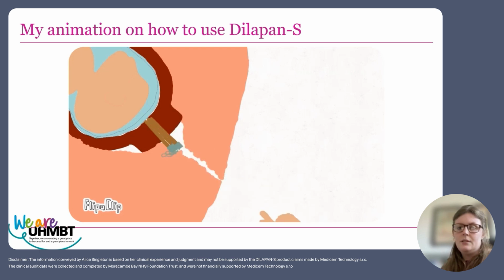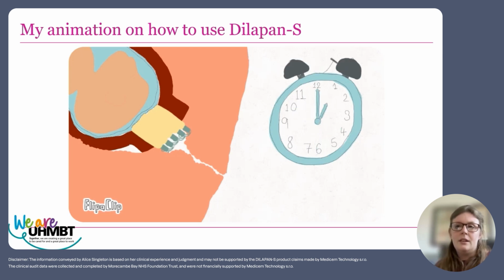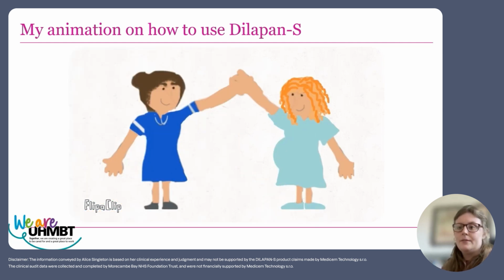In all 3 methods, you're going to do essentially the same thing, making sure that you've just put enough lubricant on the end of the Dilapan to assist with the administration of them through the cervix. You're also going to ensure, once you've administered all 5, that they are definitely through the internal os by giving them a little push up digitally. Once they've been in for the designated amount of time, you can remove them by pulling the strings. A gentle assessment is to check that we are ARMable, and it's as simple as that.